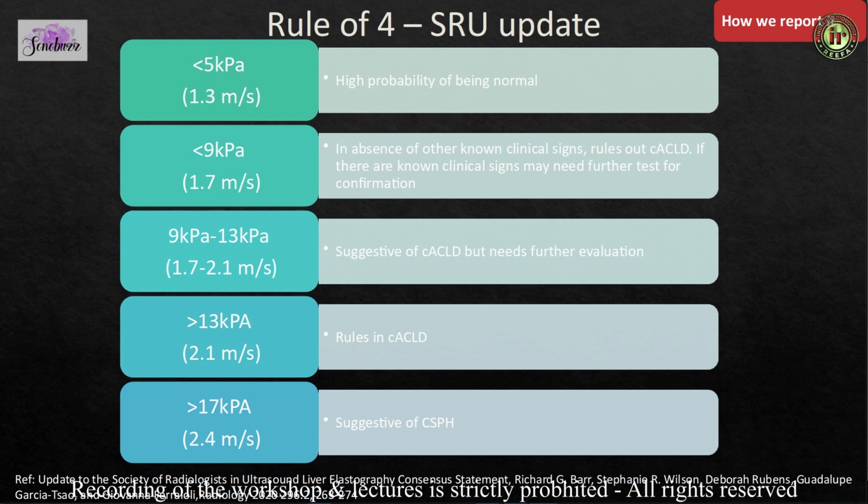So suppose the patient comes to you today, you keep that value as your baseline value, and the patient comes to you after 6 months, you look at that 6-month value in reference to today's value. And you see whether this is increased or decreased, and any change more than 10% becomes clinically significant. So this is called delta change.